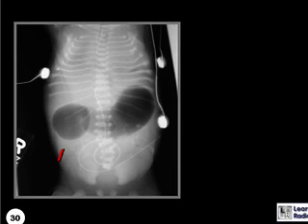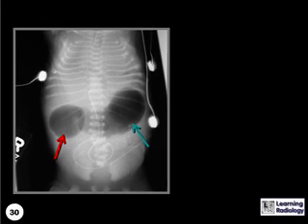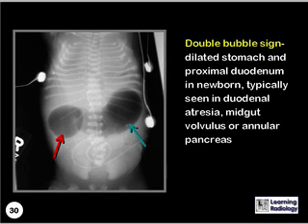What is the name of this sign? This is the double bubble sign, representing a dilated stomach and the proximal duodenum in a newborn, typically seen in duodenal atresia, mid-gut volvulus, or annular pancreas.